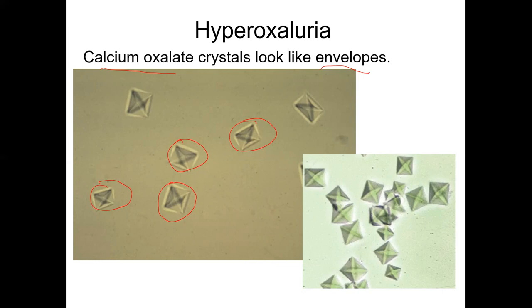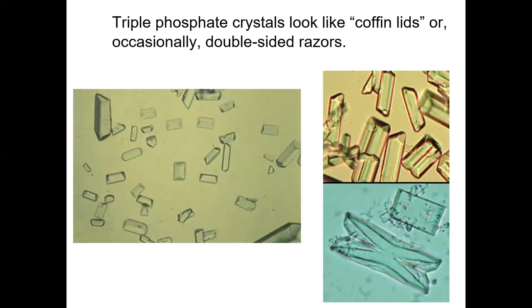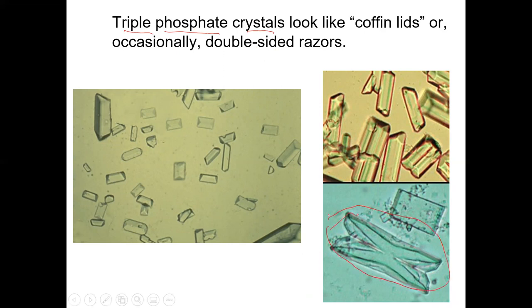These are triple phosphate crystals. They kind of look like coffins or razors — coffin blades. This is a buildup of crystals from phosphate in the urine. This one looks like a razor. An acidic pH doesn't necessarily cause triple phosphate — this is more of an alkaline problem.